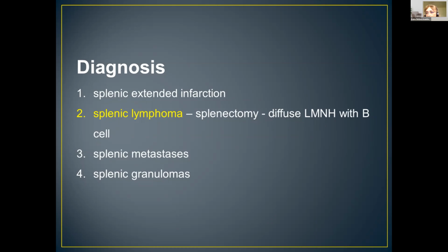So there are multiple lesions. There is a pronounced washout. So the other investigations were necessary. So counting only serious, the colleagues who said granuloma or metastasis did not answer wrong, but we must see the all context, all the situation. Can I comment a little bit?